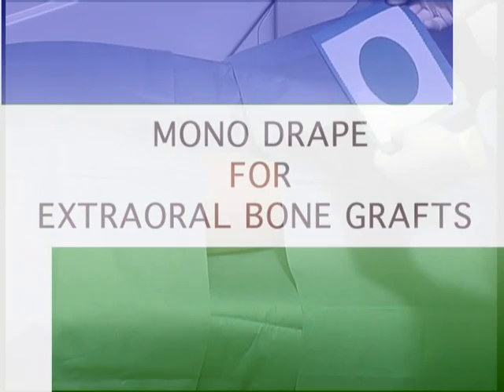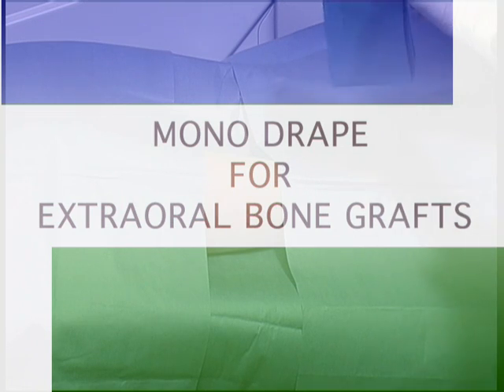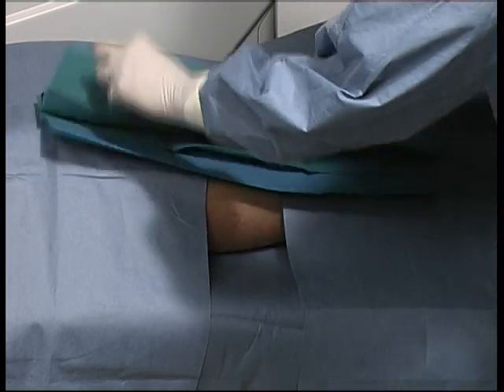Extraoral bone grafts. If the operation involves extraoral bone grafts, drapes with specific holes can be used to isolate the required area in the best way.